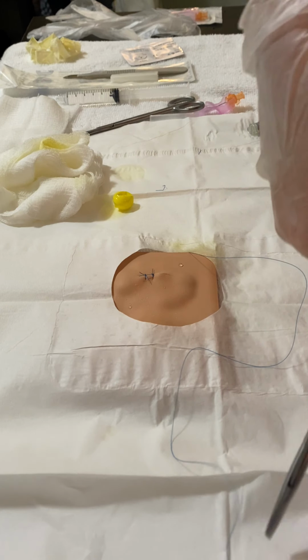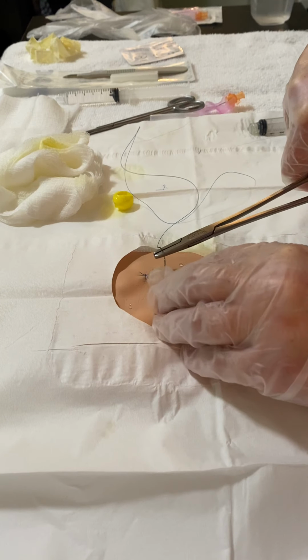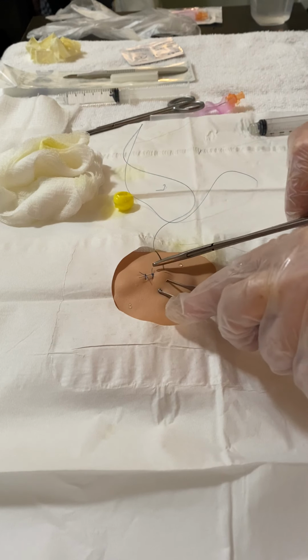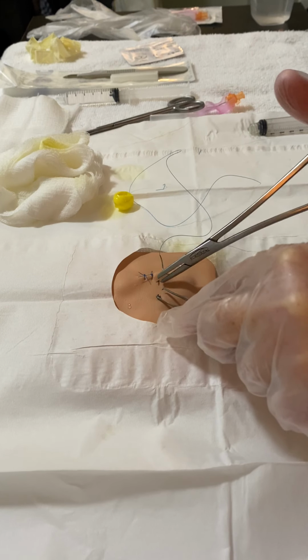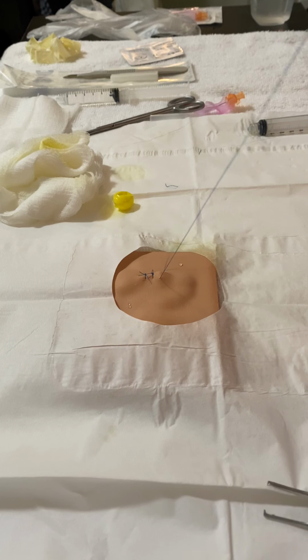And then we will go in and attempt a third and final suture. And really, we could use as many sutures as we felt we needed to fully close the area and minimize the amount of scarring.